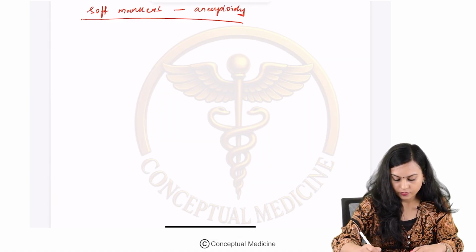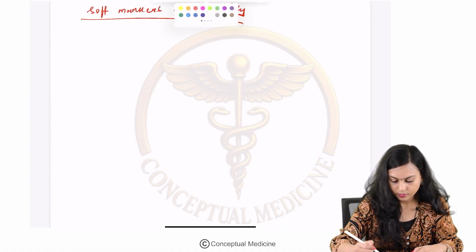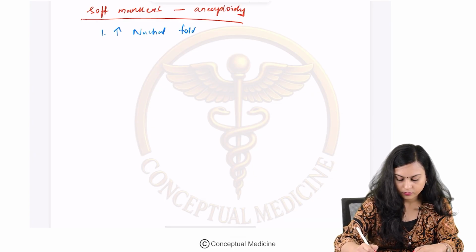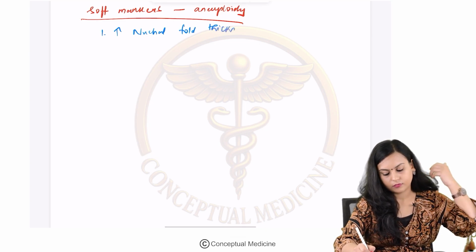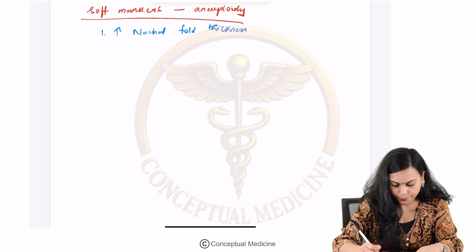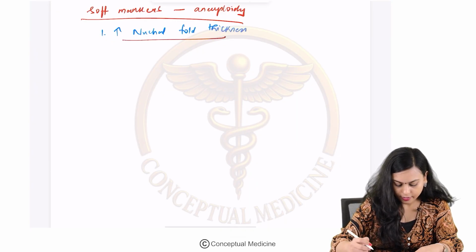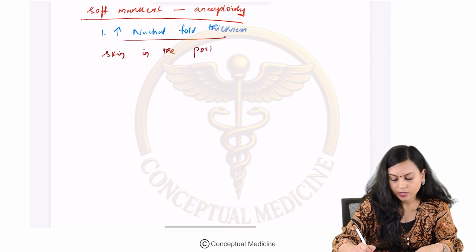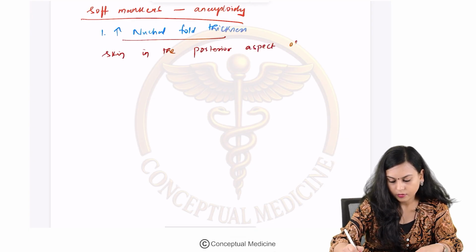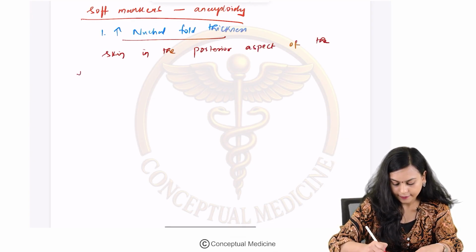So, the first one is increased nuchal fold thickness. Nuchal fold thickness means the skin in the posterior aspect of the fetal neck.